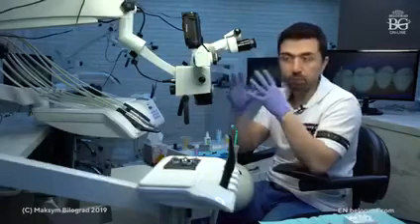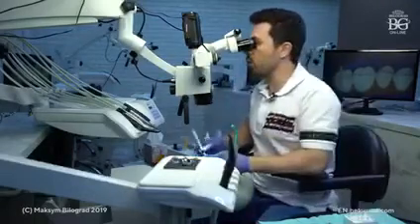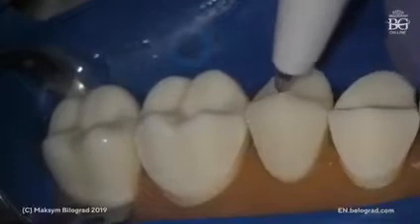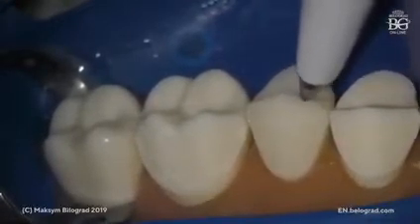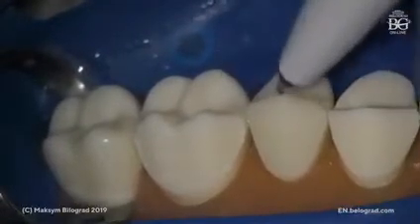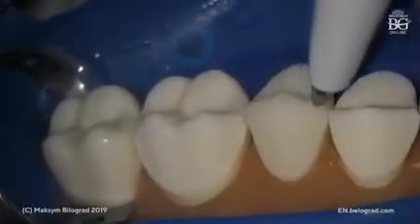Okay. The second type of preparation is when we just cut the tips of the cusps, and you can see now the sharp ridge here, exactly where the occlusal surface begins. This is the butt joint area, all the way. It's a platform.